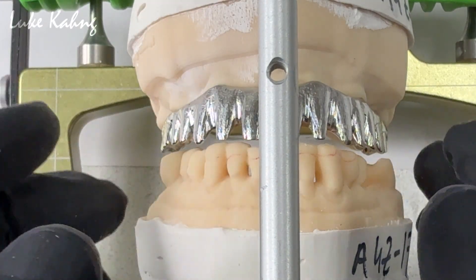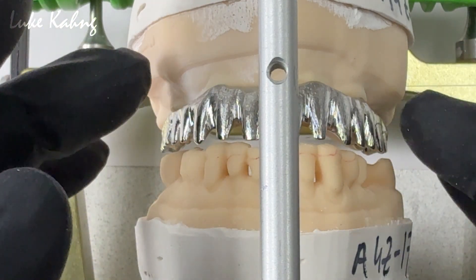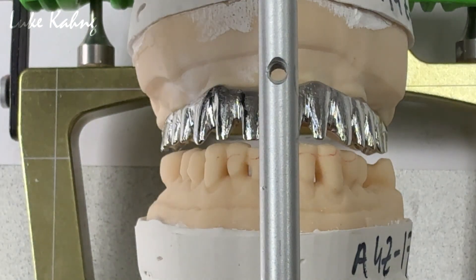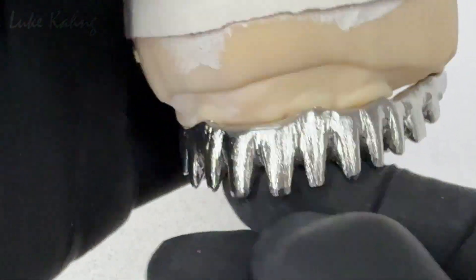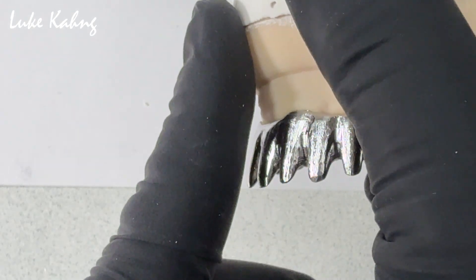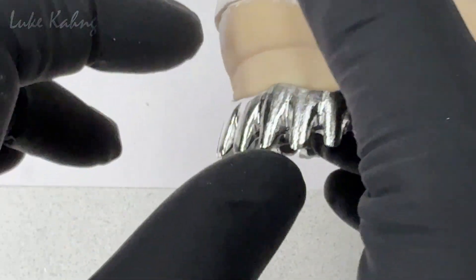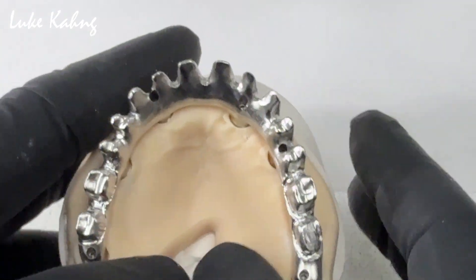It's a two-piece zirconia, about three to four millimeter facial thickness. I'm okay with that. And also I noticed that the occlusion here — the facial contour — trying to bring it in more flat in that area so I can make this better. Passive insertion draw as much as possible.